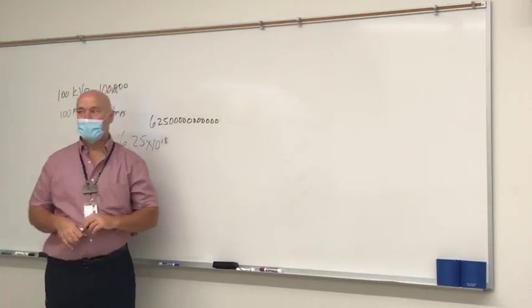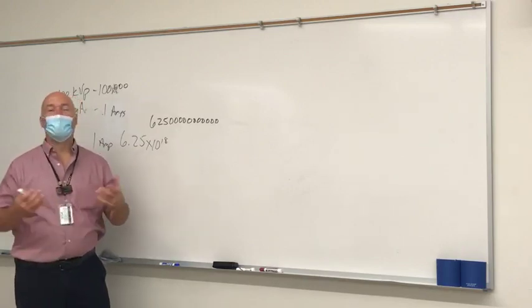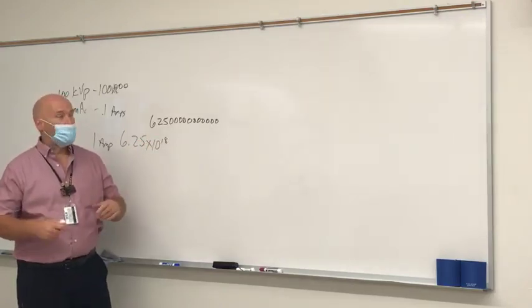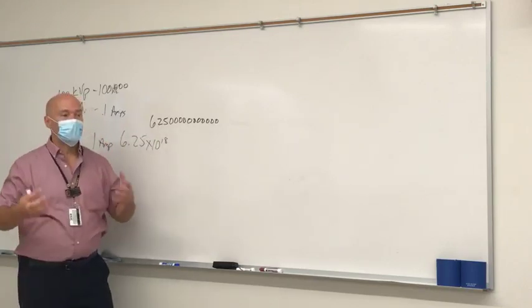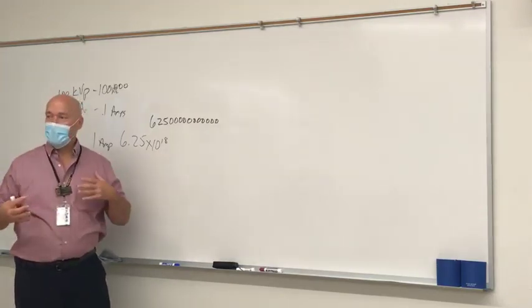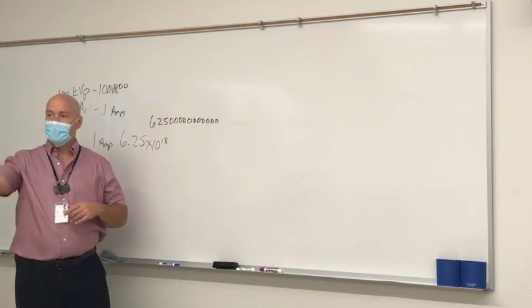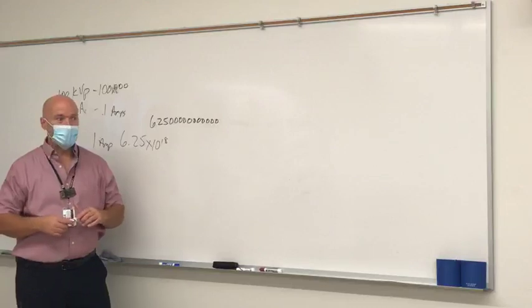Right. Still got a lot of x-rays? Yeah. So is it inefficient? Absolutely. It's terribly inefficient. But we're still gonna get a lot of x-rays out of even a small exposure. Now, we feed that into the patient, and pretty much that same scenario takes place inside of the patient. We get x-rays getting close to the nucleus of the atom, and they may create a secondary x-ray photon based on the slowing down of the x-ray photon. If they eject electrons, we're definitely gonna get characteristic out from inside of the patient.